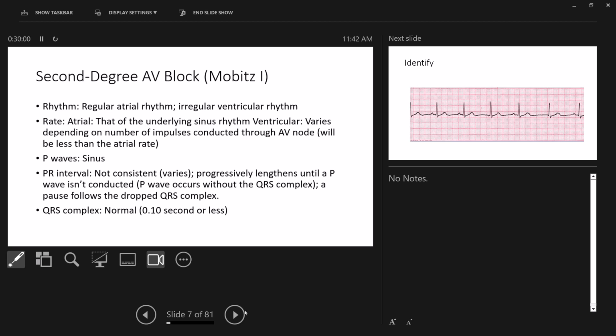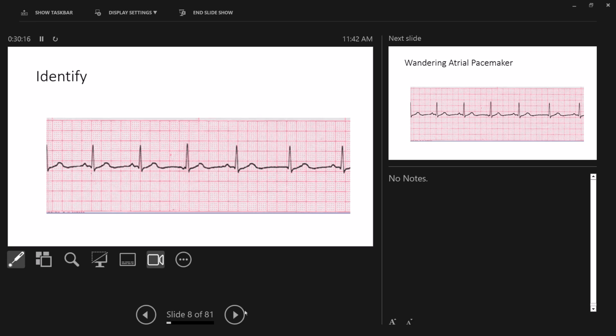But many times you go, okay, that's a heart block. And much like you did just now, Sydney, it's kind of like, is it first, second degree type 1, type 2, or third degree? If you use this up here, this will help you to get more of them right. All right?